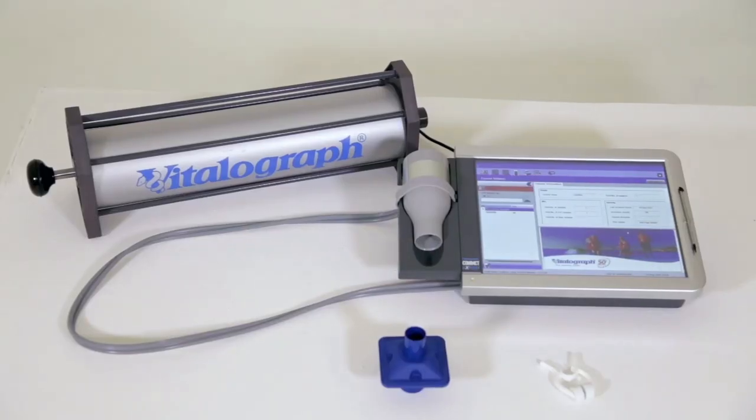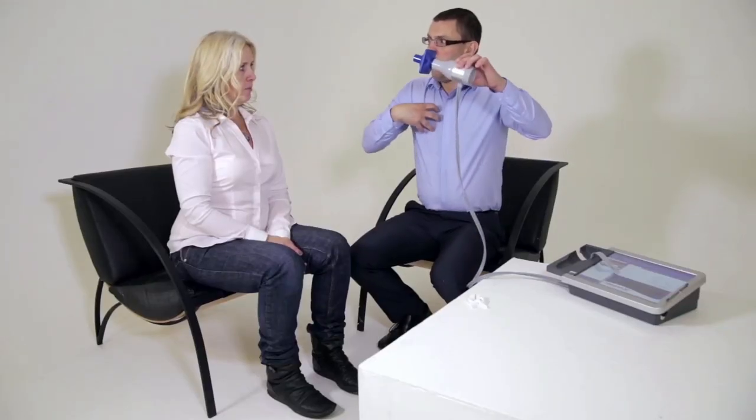The before test includes equipment preparation, patient introduction, and patient instruction.